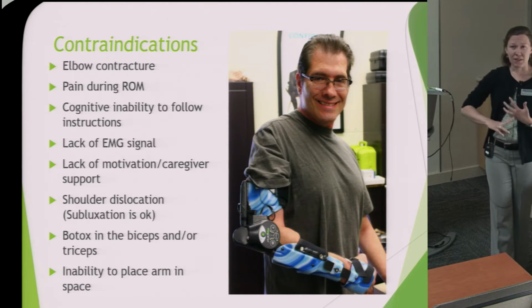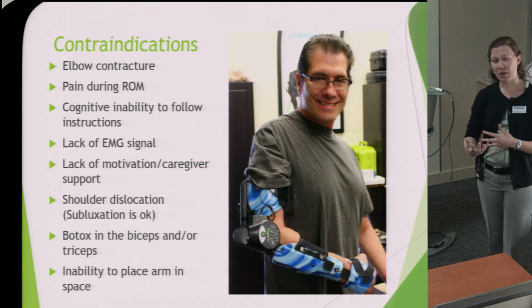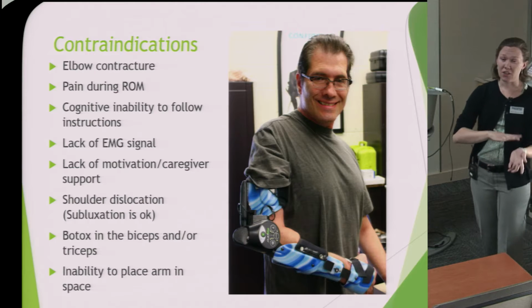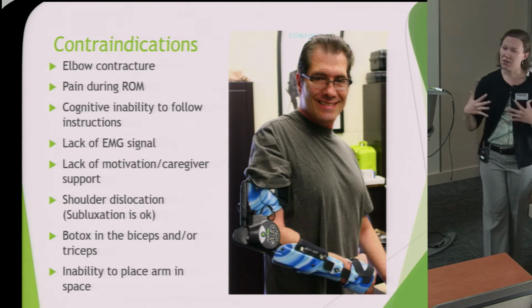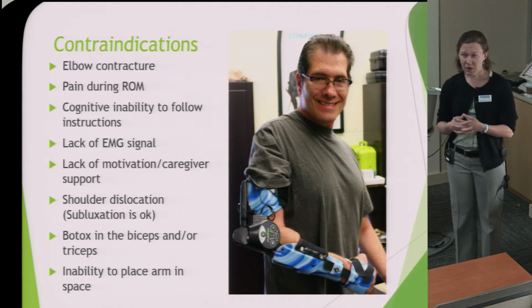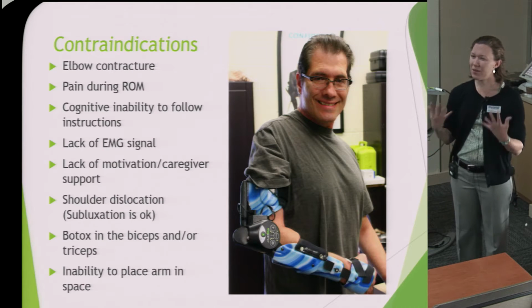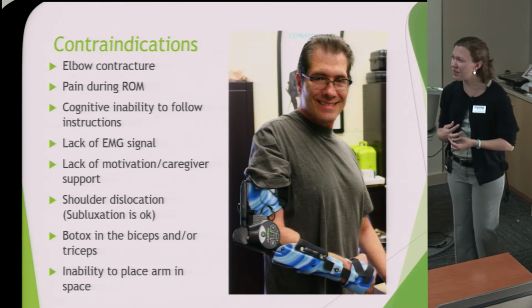Cognition we've discussed. If they have the cognitive inability to follow instructions, be that this is how you put it on, this is how you turn it off, can you bring your hand to your face, can you push against this table, those sorts of things. If they don't understand what that means, then they're not going to be a good user. If there's a total lack of EMG signal, they're not going to be a potential candidate because they can't power the device. As I said, it does work off of EMG signals.